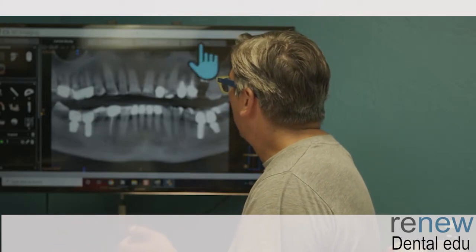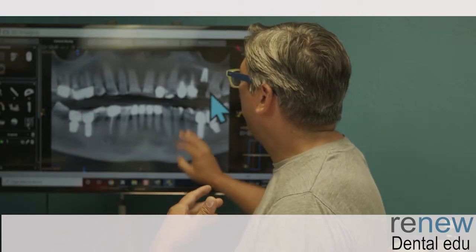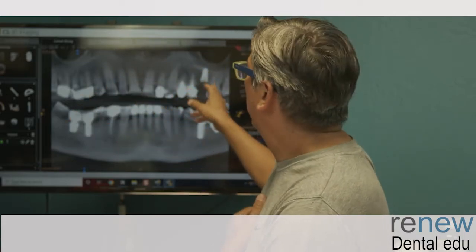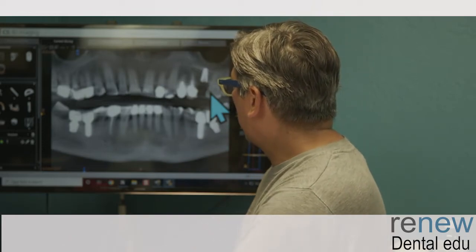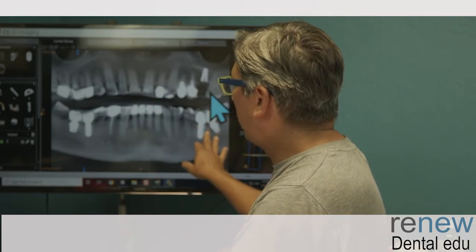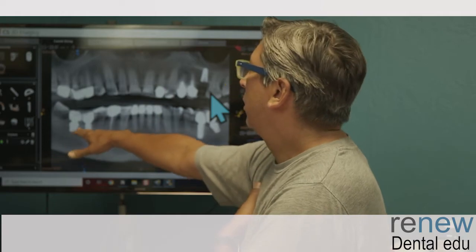implants or an implant up in the same situation as the number 3 up in number 14, just hugging the sinus here, looking at possibly a little angulation, but no big deal. The bone height is still really, really good, high quality implant, holding onto that bone in a particular mouth that seems to be really pretty hard on things.